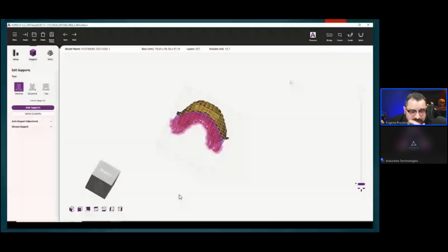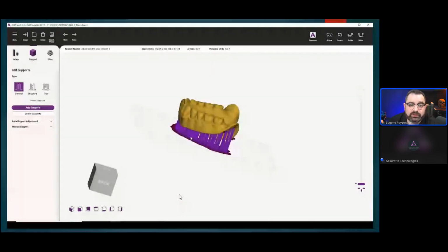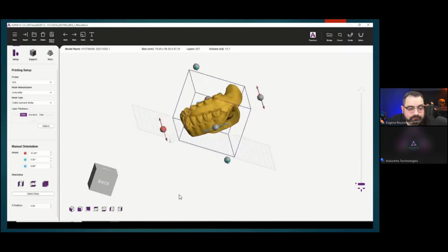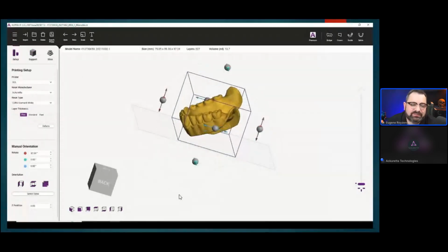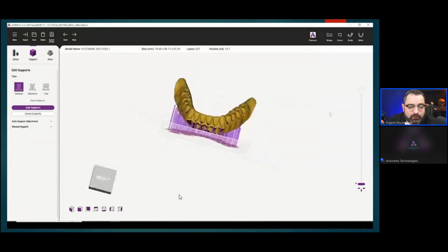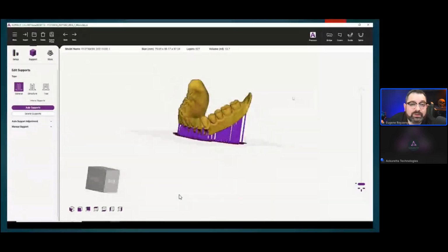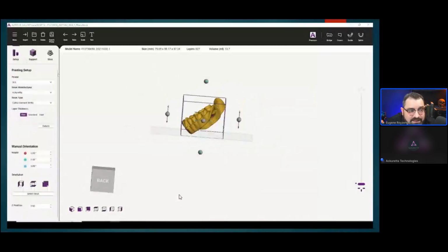So this talks about the actual supports on the intaglio. You see how many supports there are? It just makes it really difficult to reline. But if I'm doing a reline impression, that's no longer an issue, right? But if I angle it about 45 to 70 degrees, usually around 70 degrees, you'll get the best of both worlds, where the teeth are not too fully covered, and you don't have too many supports on the actual intaglial surface.